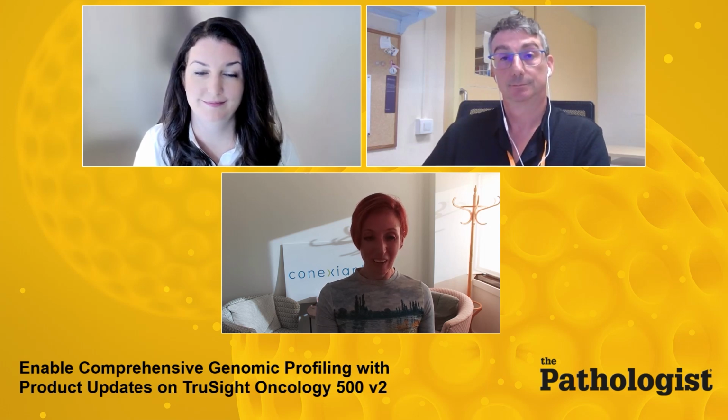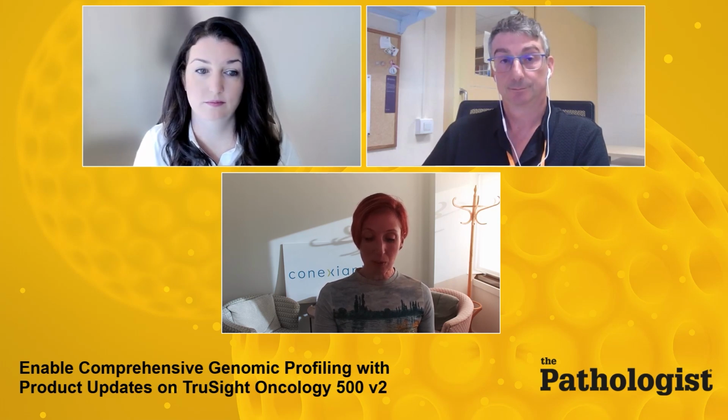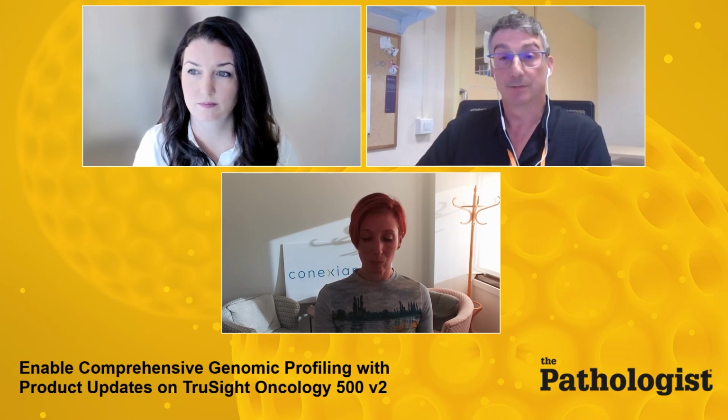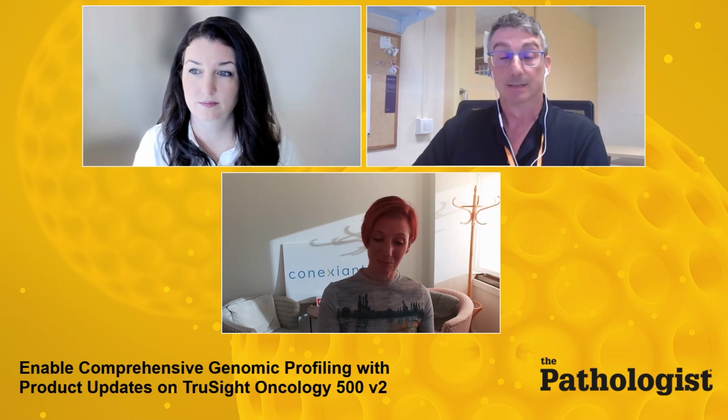Great. And for Daniel, do you report RNA or DNA only results if the other library does not meet QC standards? Okay, it depends on the necessity of the result for the patient.